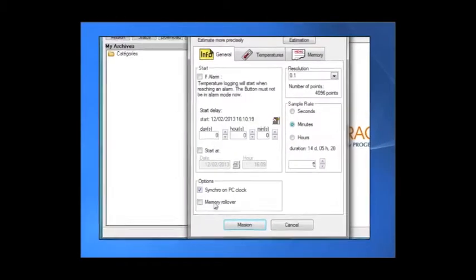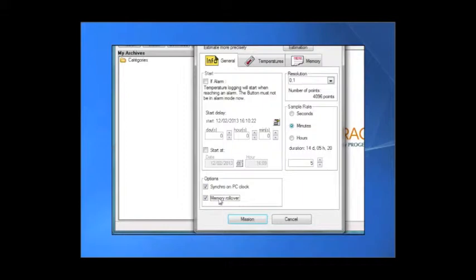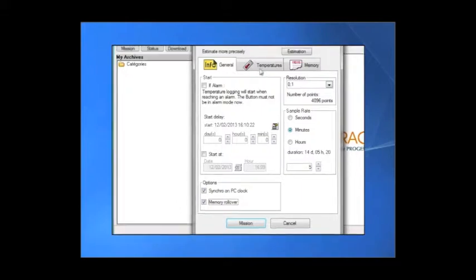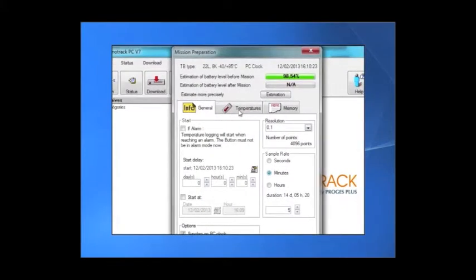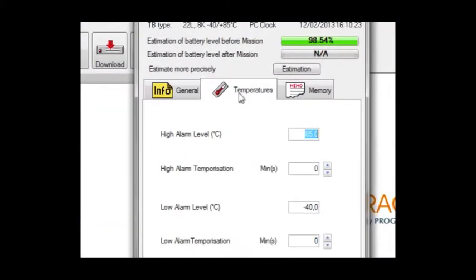You can activate the memory roll over. Now, select the alarm thresholds.